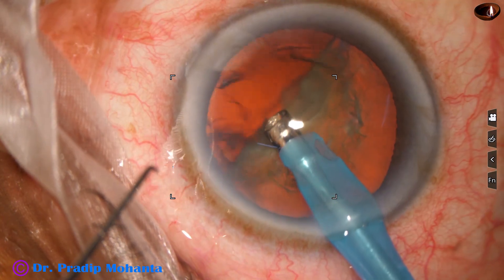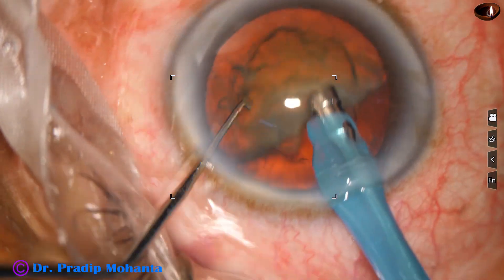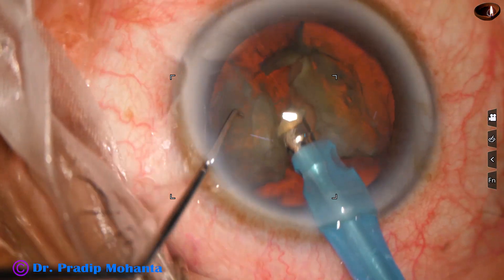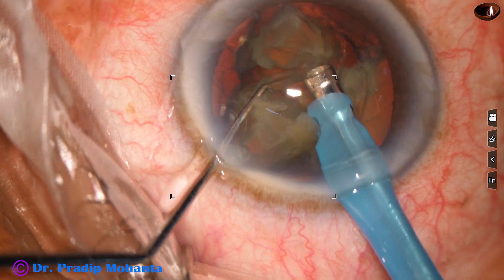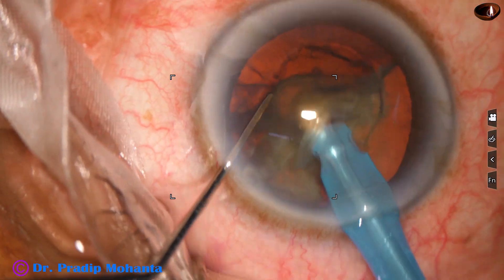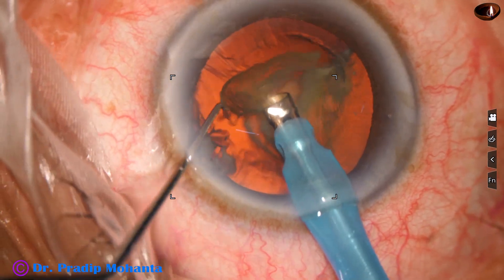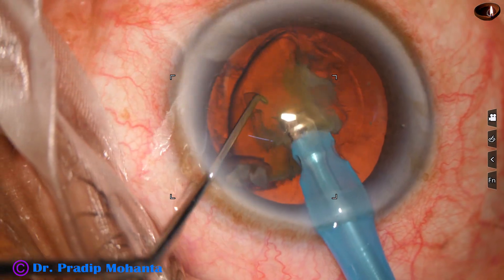Now we come to the other heminucleus. It is chopped into two large fragments and then each nuclear piece is tilted. It is subdivided into two more pieces and they are emulsified with ultrasonic energy and removed. We can remove the pieces very easily with ultrasonic energy. This is the last piece.